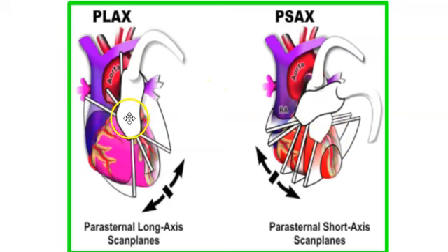And our index marker for the long axis is pointing this way towards the patient's right shoulder. And in this one here, it's pointing towards the patient's left shoulder. You picture the person here, their head here, and their feet here, and their arms here. We rotate the probe clockwise about 90 degrees from here, right? We're going to go right over to this point here, and we get our short axis views by aiming up or down and by moving up or down a rib space.